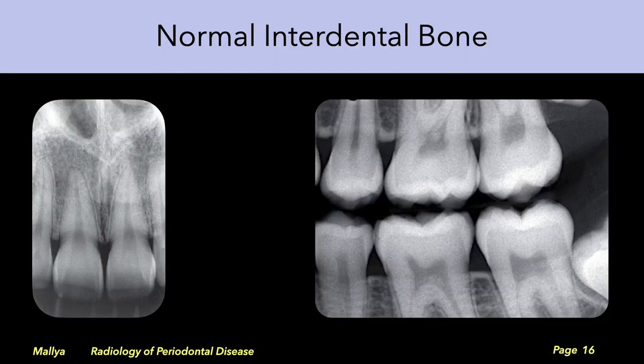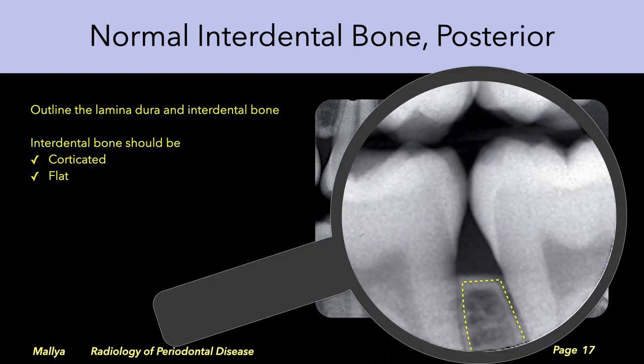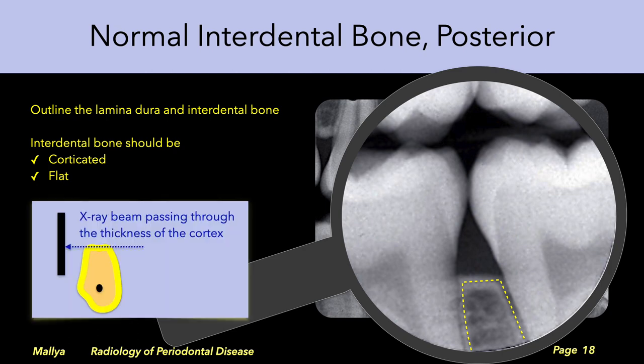Now let's examine the radiological appearance of interdental bone on periapical and bitewing radiographs, focusing on the posterior region and in particular the interdental bone between the mandibular molars. Outline the lamina dura adjacent to the teeth and continue on to the interdental bone. The interdental bone should be corticated and flat. Note that in order to appear adequately radiopaque, the x-ray beam should traverse through a sufficient thickness of the cortex of the interdental bone.